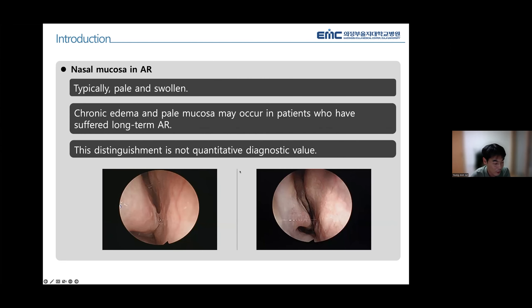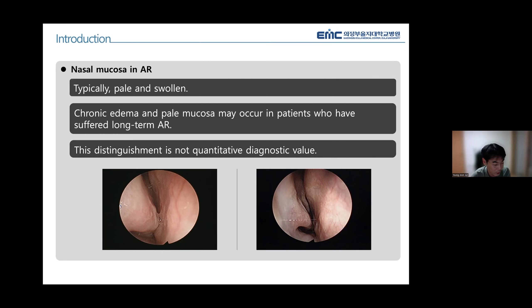Nasal mucosa state is frequently observed in otolaryngology clinics, and nasal mucosa change is one of the vital pieces of information used to treat patients. In allergic rhinitis, the nasal mucosa typically exhibits a pale or swollen appearance. Chronic edema and pale mucosa may occur in patients with long-term allergic rhinitis, but this distinction is not a quantitative value.